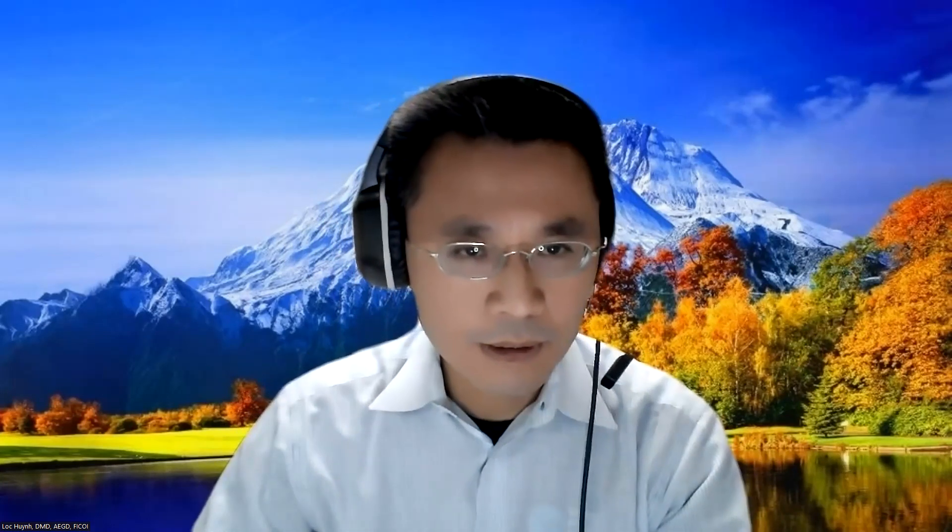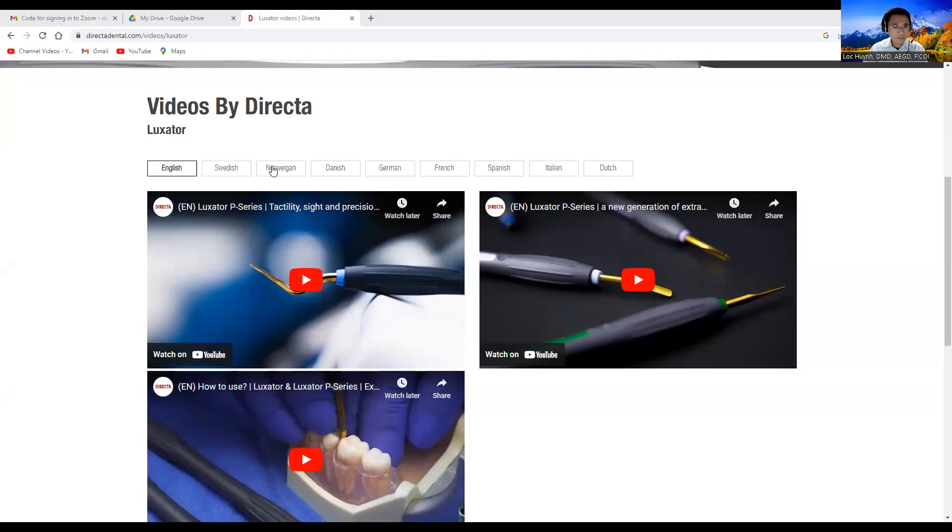I want to share my screen for you guys and show you some video. This is directly from the company called Directa Dental — Directa Luxator. You can go to www.directadental.com and search for the video. Let me show you this right here.